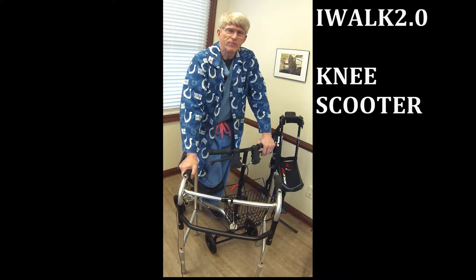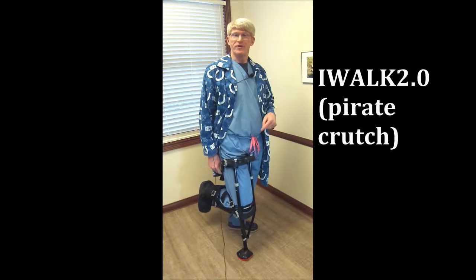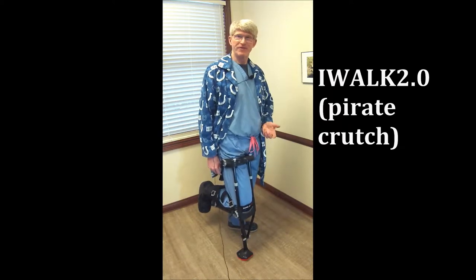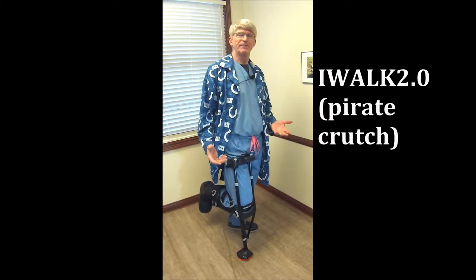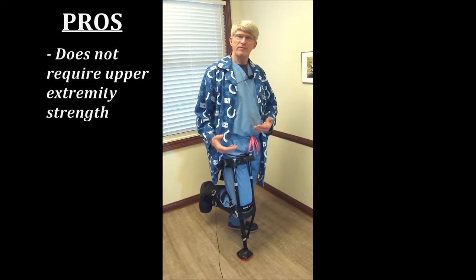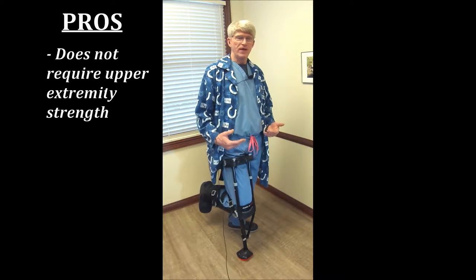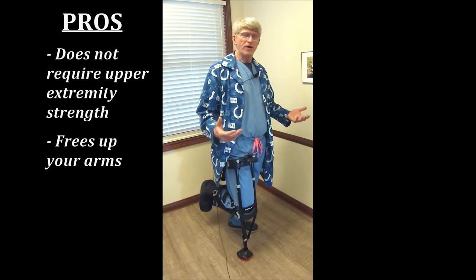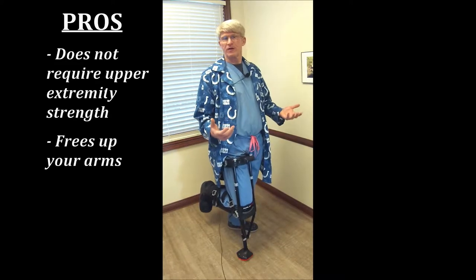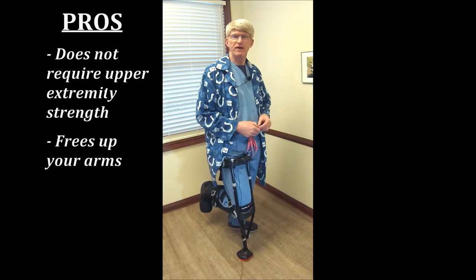So today, we're going to talk about the iWalk 2.0 and the knee scooter. This is the iWalk 2.0, or as I like to call it, the pirate crutch. Now, this will appeal to a certain population, and it really has a big benefit if you have an upper extremity problem — a shoulder problem, elbow, or wrist problem — and you can't use crutches or a walker. It also frees up your arms. You can walk around and have free access with your arms, unlike crutches, so you don't have to carry a backpack or a bag with it.